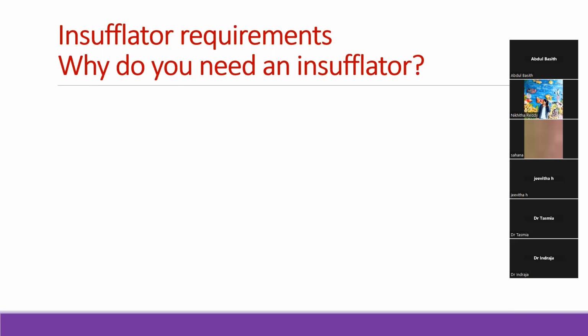Yeah, why do you need to maintain the pressure? Sir, high pressure is harmful, and low pressure, there won't be enough room for the operating. Low pressure means no space.